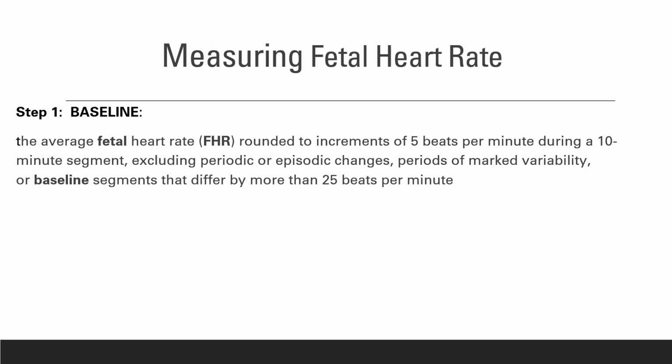The newborn fetus in utero does have a higher heart rate than normal adults. So again, please make sure you know what is normal for fetal heart rate. First and foremost, you want to establish the baseline. Just like adults, we all have different baselines. Same with the fetus.